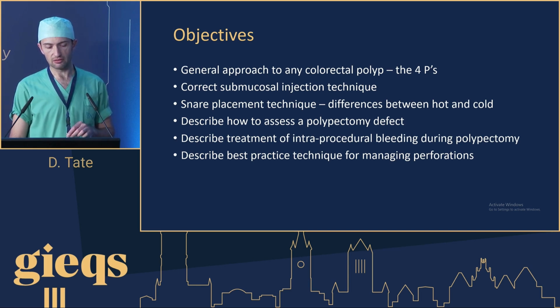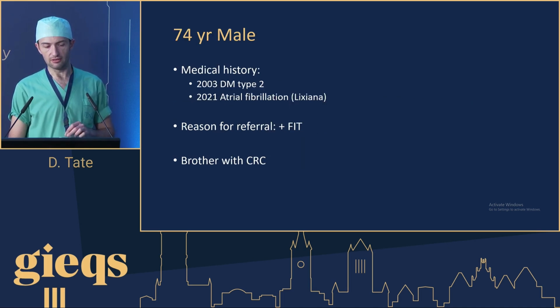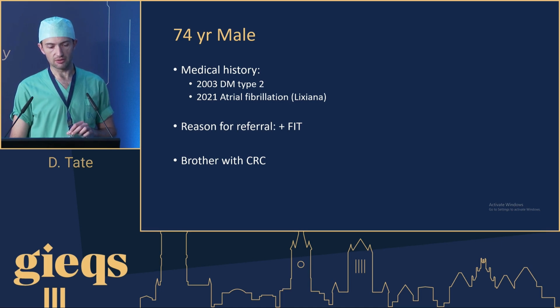We're going to describe the treatment of intraprocedural bleeding during polypectomy, and we're going to describe a best practice technique for managing perforations. So you might notice that that's all the components of the GPAT, and we will therefore later on in the day use the GPAT. If you don't know what the GPAT is, it's the global polypectomy assessment tool that we developed, and you'll find it just next to the toolbar where you're watching GIEQs right now.